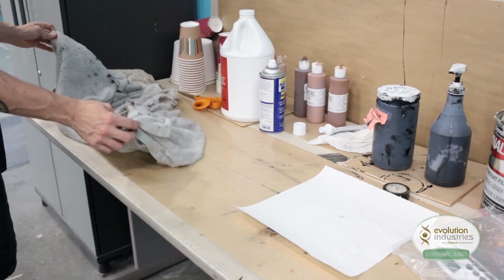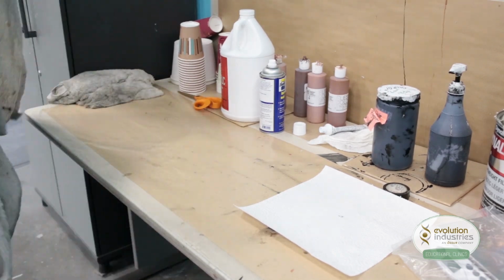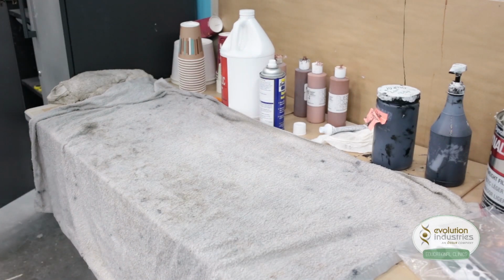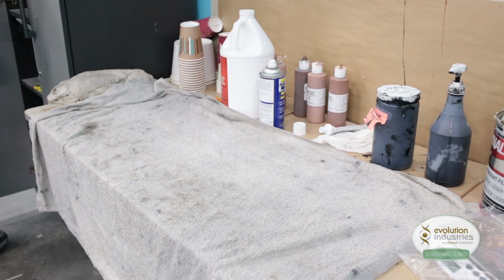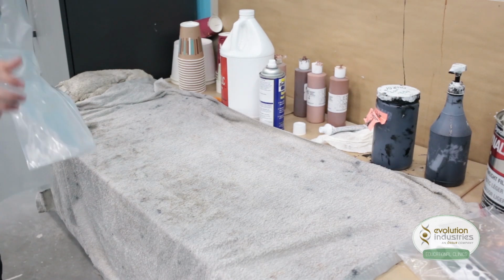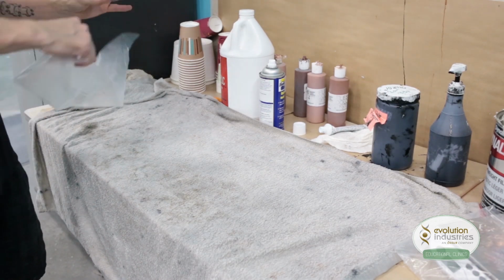Okay, the first thing we want to do is we're going to wet our PVA bag. That way by the time we're done our layup, it'll be nice and soft and ready to pull over. It's a fairly small cast, so I'm going to use an 8-inch PVA bag.